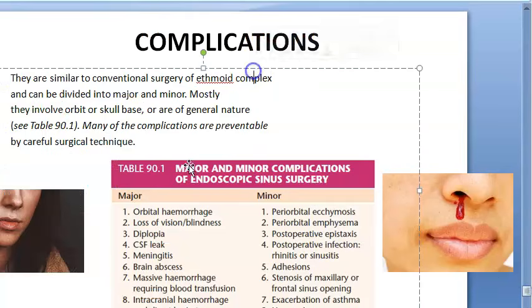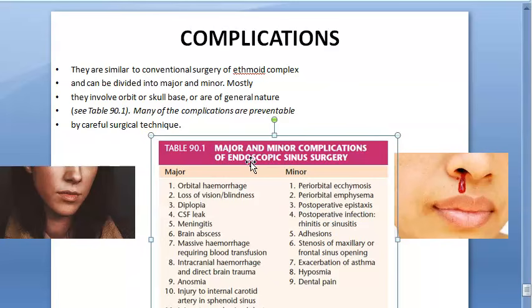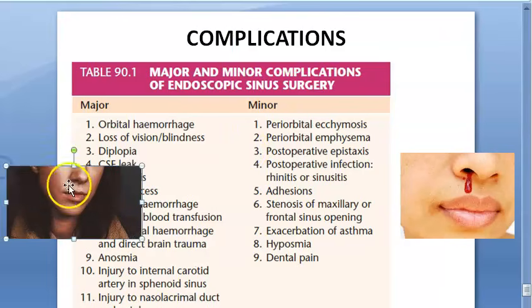Complications of the surgery, guys. FESS is very similar to the conventional surgery, but obviously the complications will be minimal. They can be prevented, or minimized, if you have careful surgical technique. Let us look at the major and minor complications.